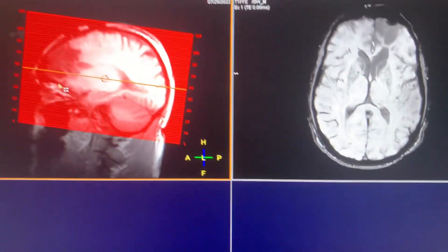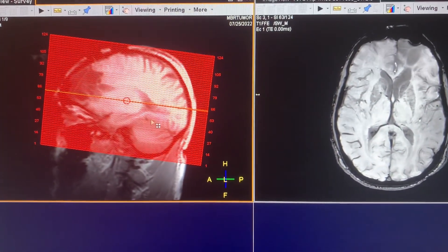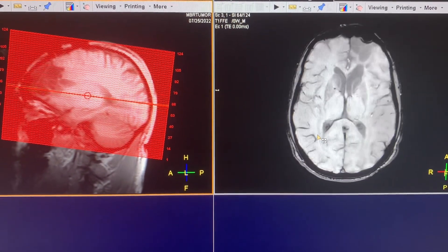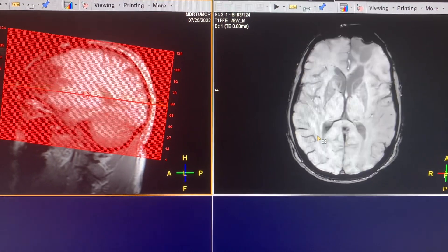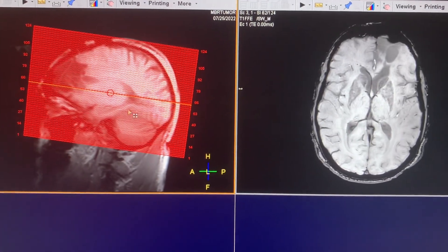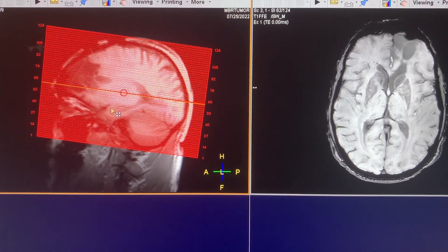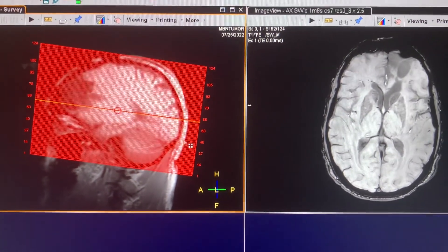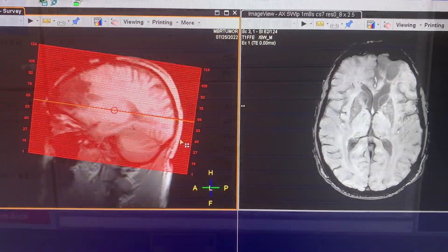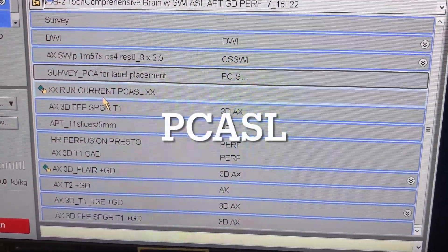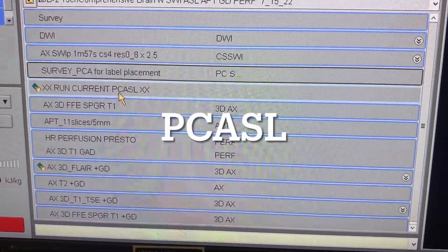Here is how you set up the SWI — just the regular way. You can see the sequence on screen and on the left are the settings. Just cover the brain. All right, let's move on. Sequence number three is pCASL.